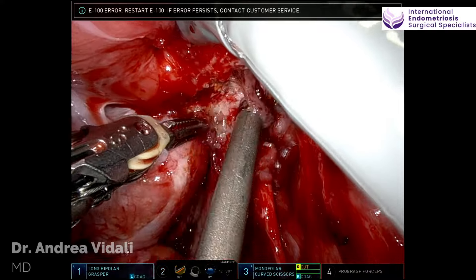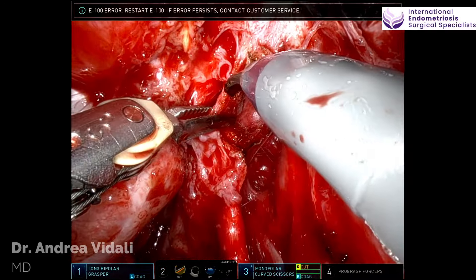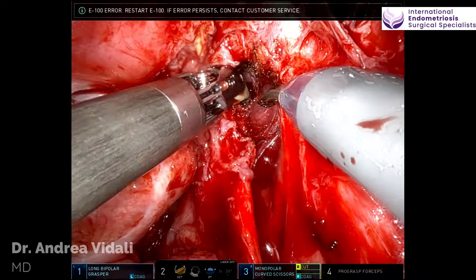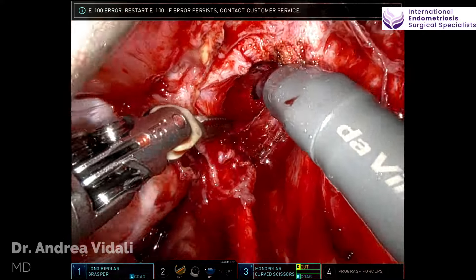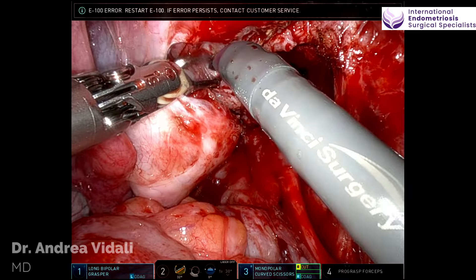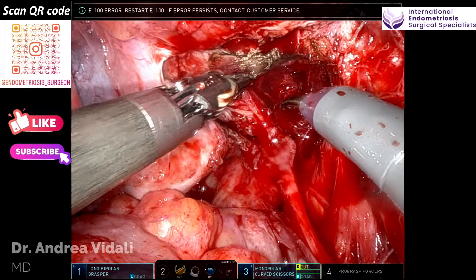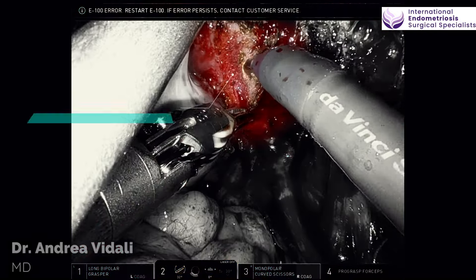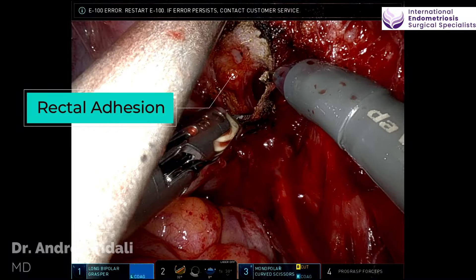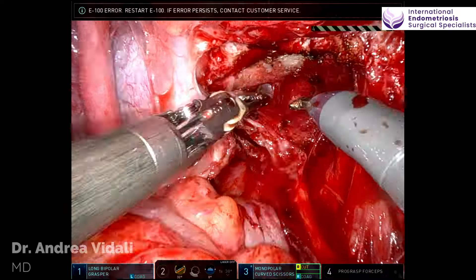You never really have a right-handed or a left-handed. The instruments that I choose robotically are placed taking advantage that every surgeon with a robot can be an ambidextrous surgeon. What this allows us to do is to actually take advantage of the ability of using traction medially. Remember that the disease in endometriosis is always in the center of the pelvis.